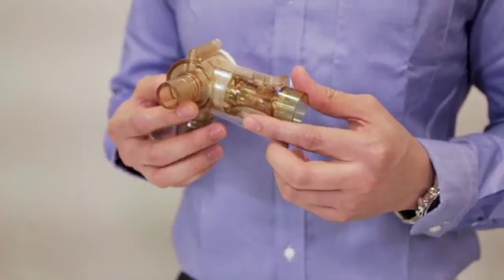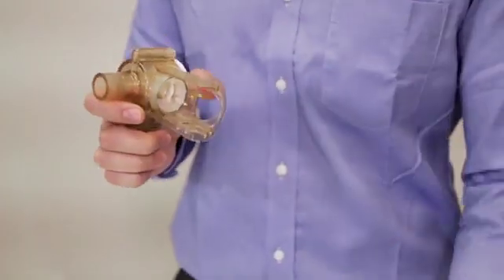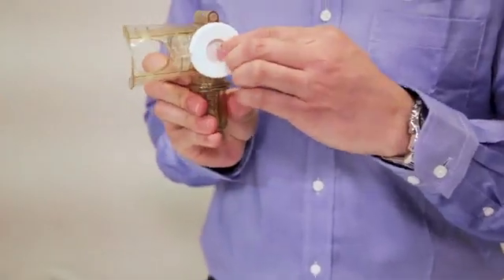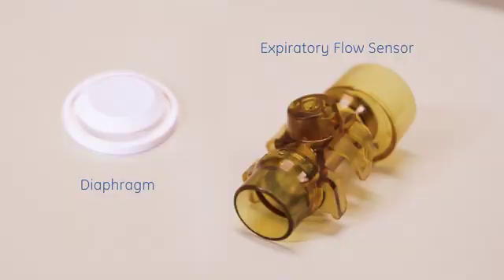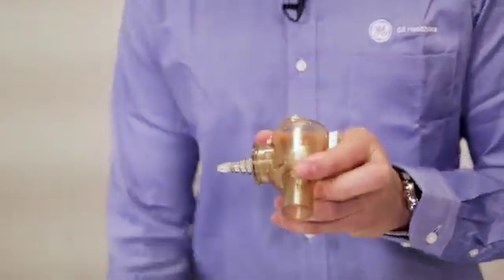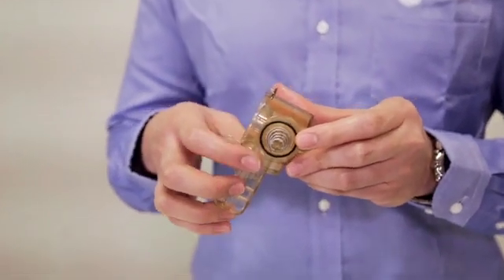This is the exhalation valve assembly. You have the expiratory flow sensor, the diaphragm, water trap, the spring-loaded plunger, and the o-ring.